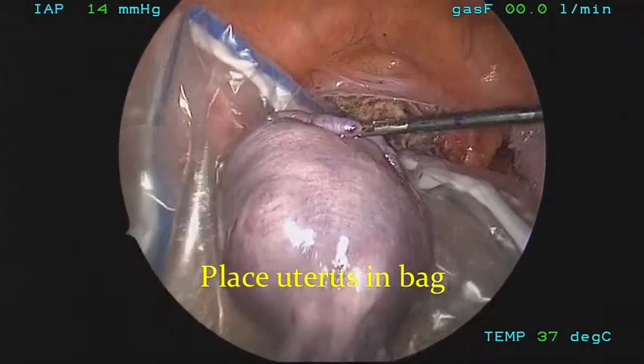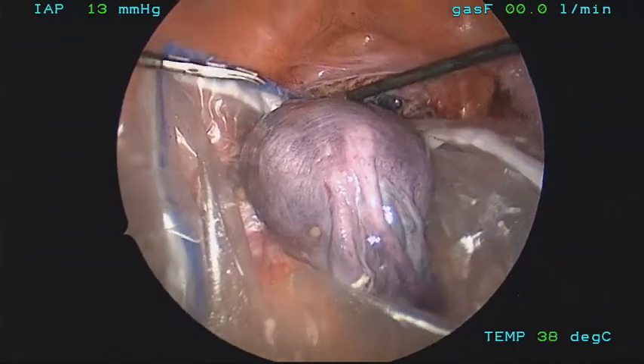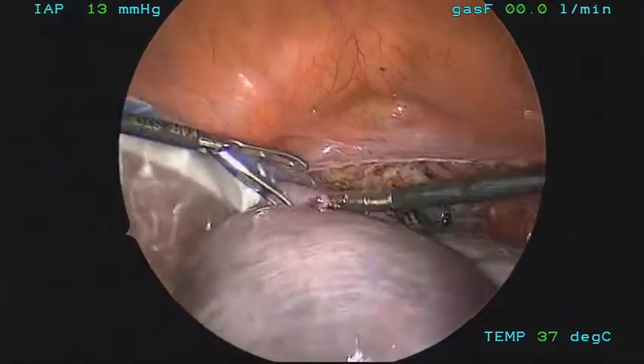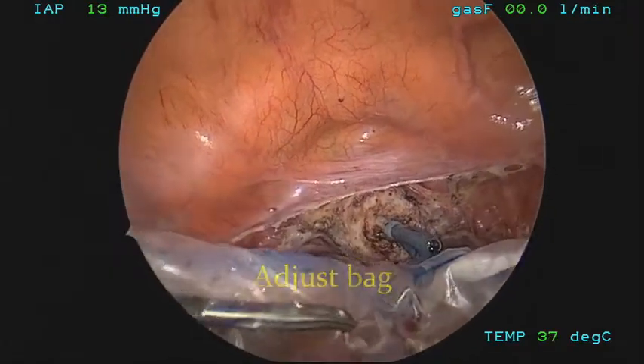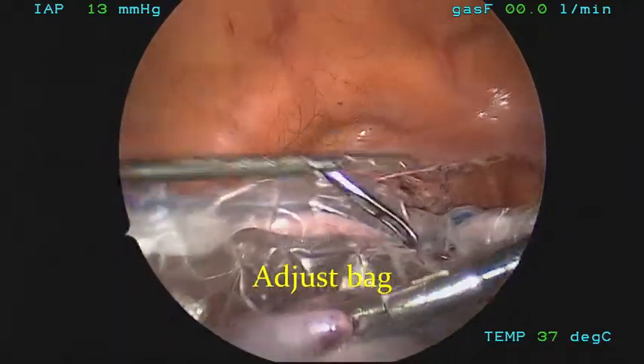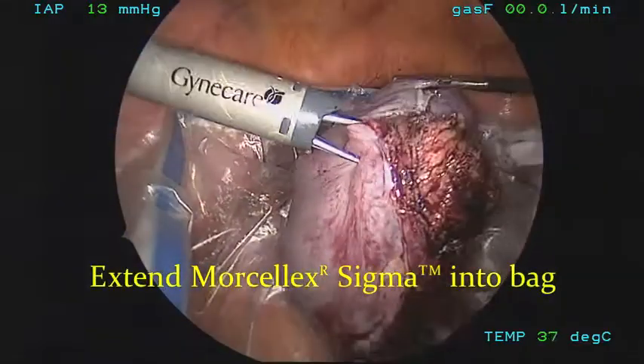Now the uterus is removed from the manipulator. The manipulator is brought out of the cervix so as not to puncture the bag. The bag will then be elevated upwards — you can suture the bag, attach the bag, or clamp the bag to keep it elevated. We've also added tabs at this point to hold the bag up.